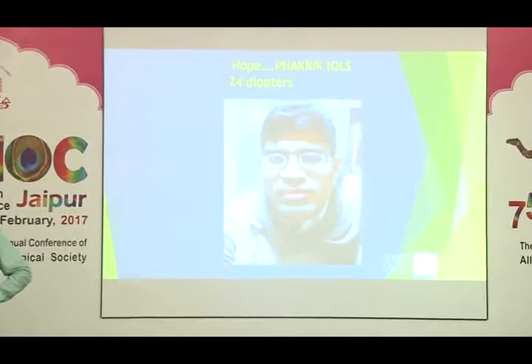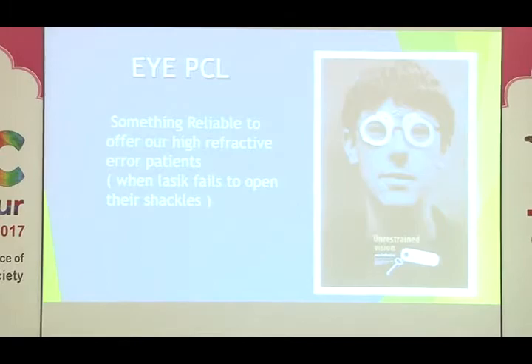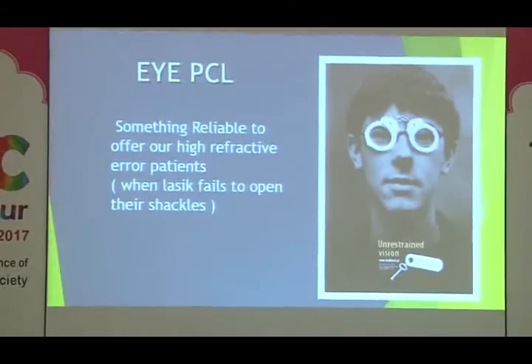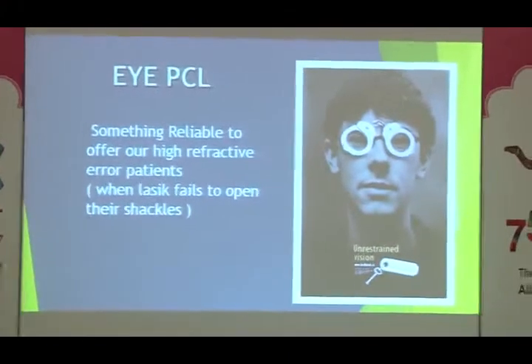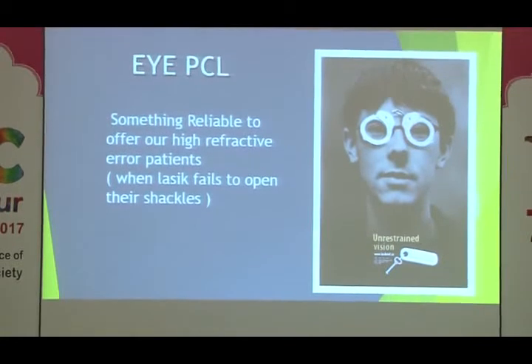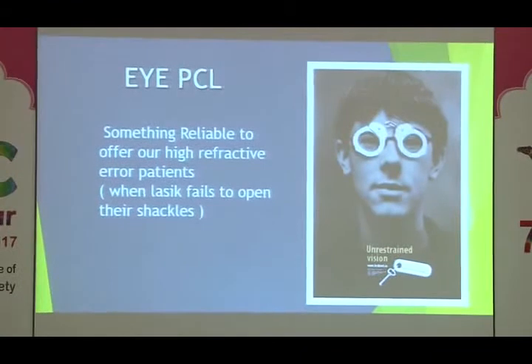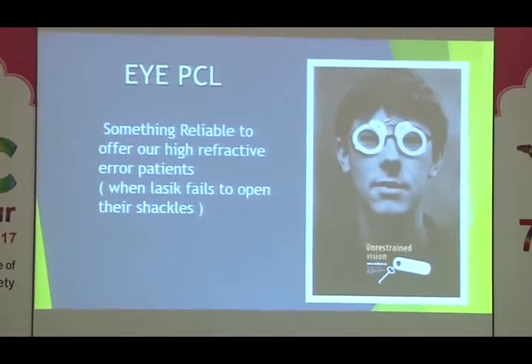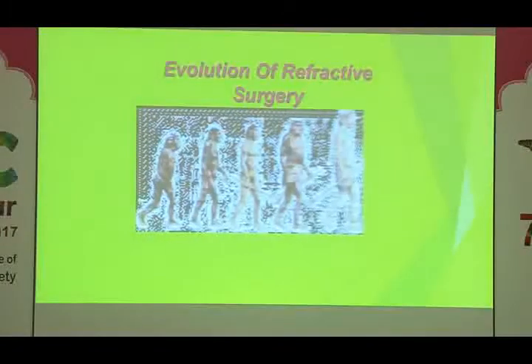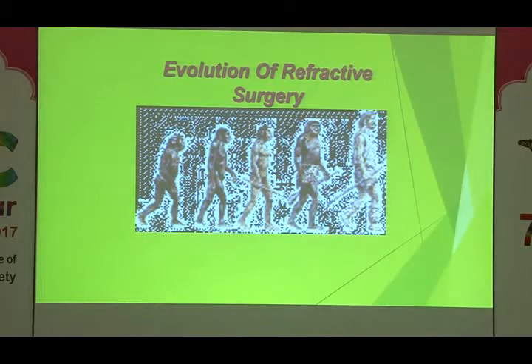In fact, I was just in a debate 3 weeks ago at the IARSI Noida, where I was pushing phakic lenses for moderate to a little higher myopic powers, which are probably fit for LASIK also, you know, 6.5. I'm slowly decreasing the bar because over time, having done both, I do both. I do femto cataracts, I do femto LASIKs, I do phakic lenses. The best advantage of this particular procedure, I guess, is the reversibility and the optical quality of vision which you can give to these patients.